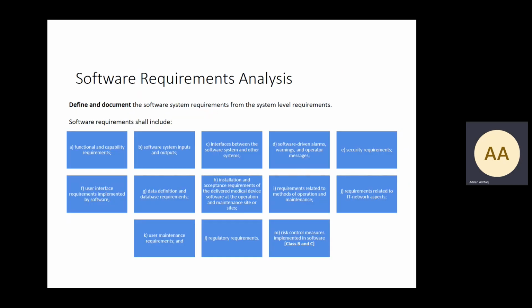Okay, so moving on then to software requirements analysis. In the software requirements analysis, it's very important that you define and document what the software system requirements are from system level requirements. So the software requirements need to include the following.